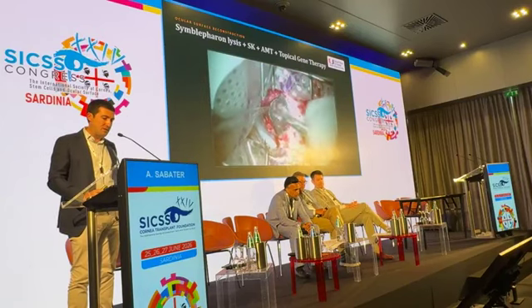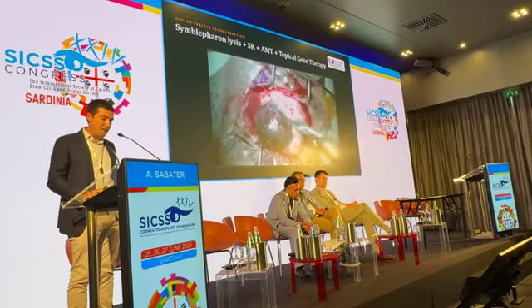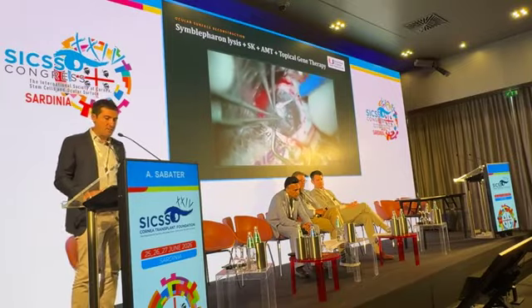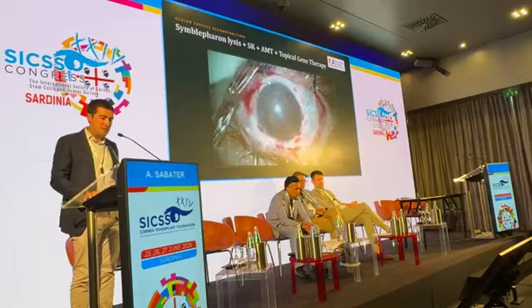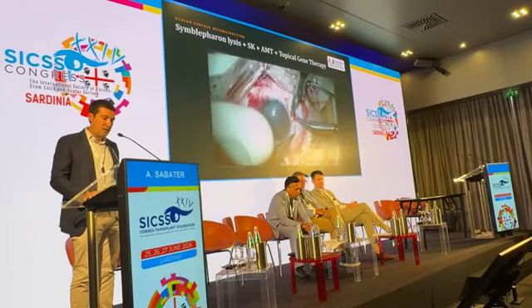Then it's just a standard superficial keratectomy where we remove all the conjunctival tissue. There was already some scar tissue because there were many years with this issue, but anyway, the cornea, as you can see, looks pretty nice after removing all that scar tissue.